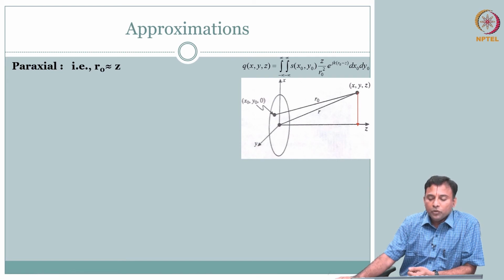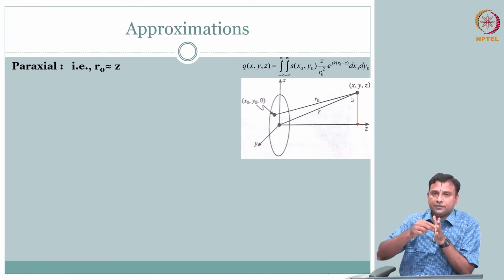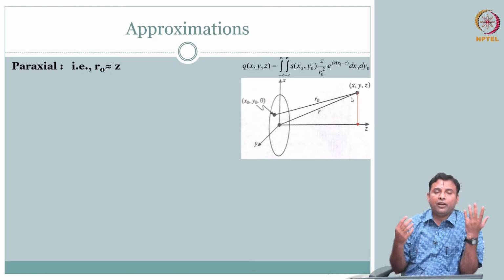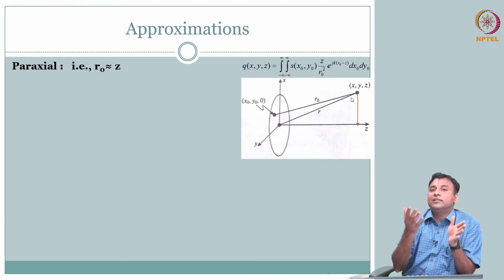What we are going to do first is, we are always interested in something at the center of the transducer, because in the end everything falling on the surface is going to get captured. So if I have to register that, I will have to register that at x naught, y naught, 0, for example.